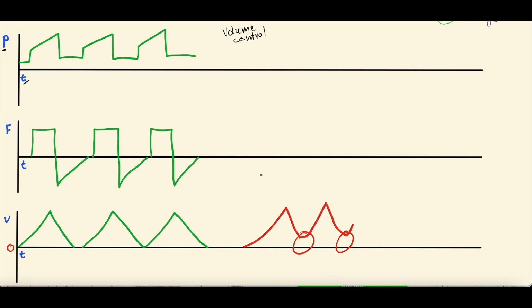Let's pretend the tidal volume is 400 cc's. You get 400 cc's in, but only 350 cc's out before the next breath. If we're being thorough, the way these scalars tend to look is that there's a really prolonged expiratory phase, so it goes up, and then the patient takes a long time to breathe out.